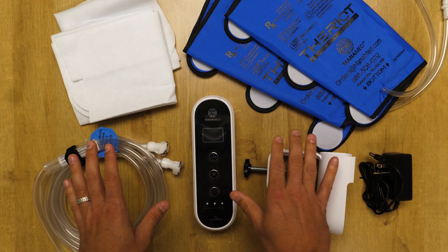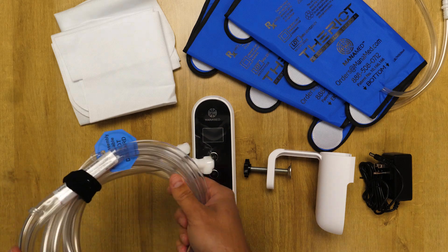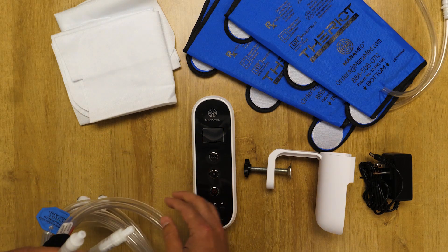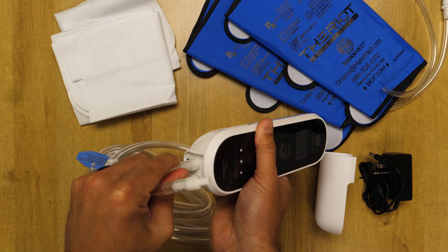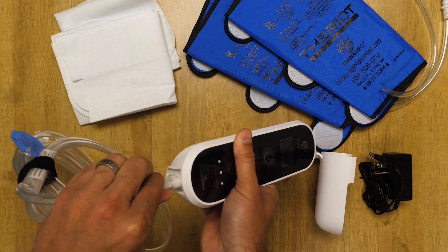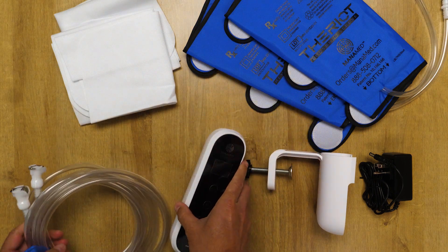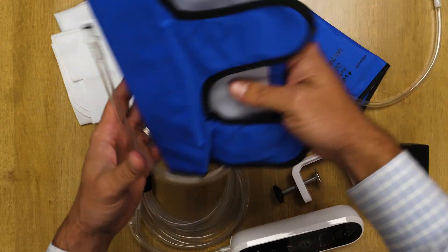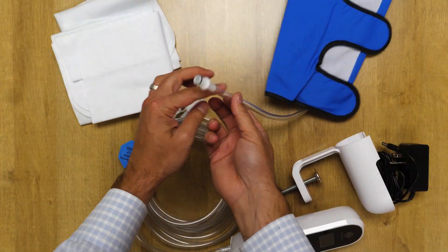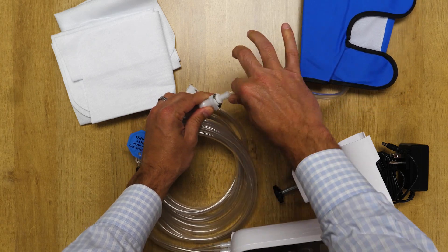To set this up in a reusable fashion, you go ahead and take the bottom portion of the tubing and insert it into the bottom of the device like that. Then you connect a reusable sleeve by inserting it into the tubing and hearing an audible click.